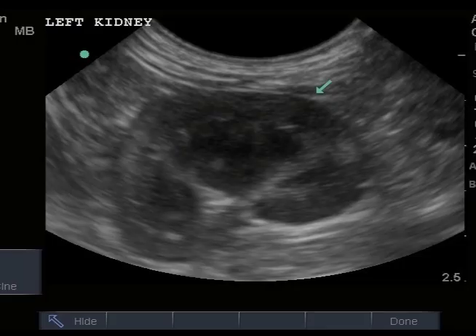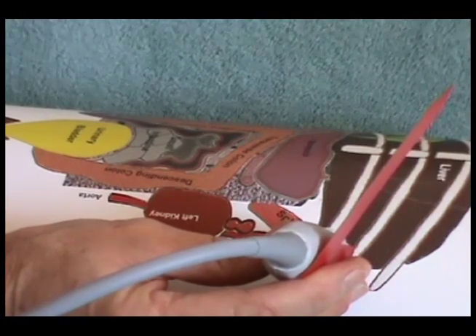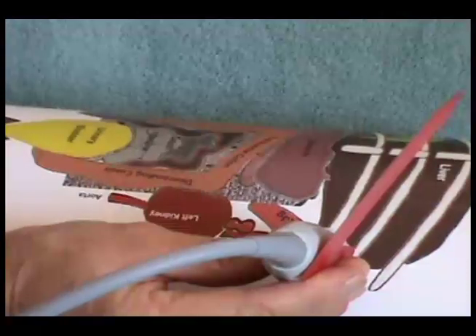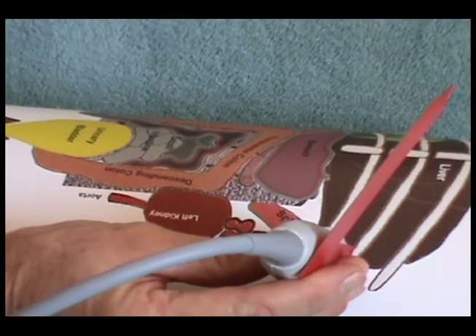Kidneys are encapsulated organs with 2 primary densities, a homogeneous cortex and a hypoechoic medulla. When we finish with the spleen, the transducer is in an off-sagittal position on the left lateral abdomen and cranial to the last rib. In dogs and cats, the left kidney is usually caudal to the last rib.